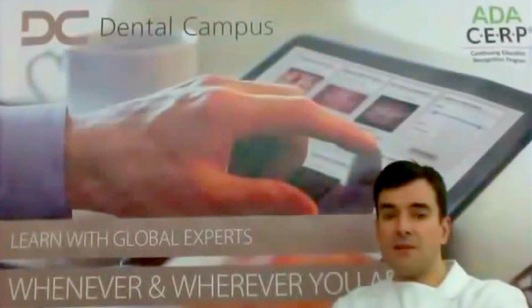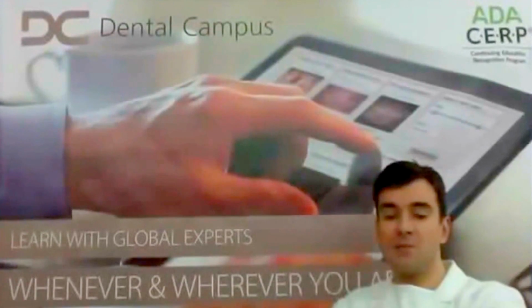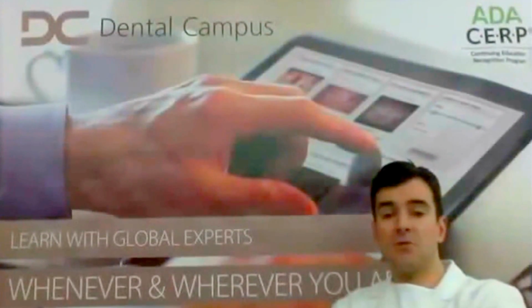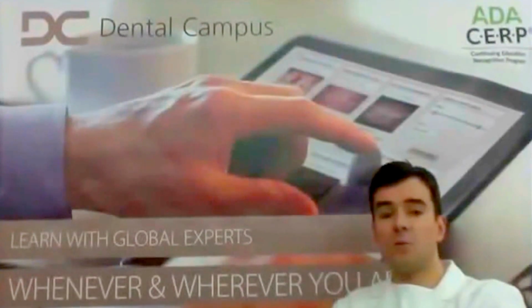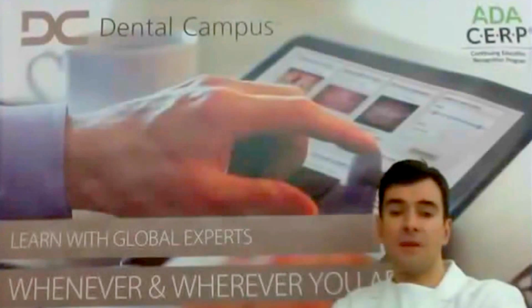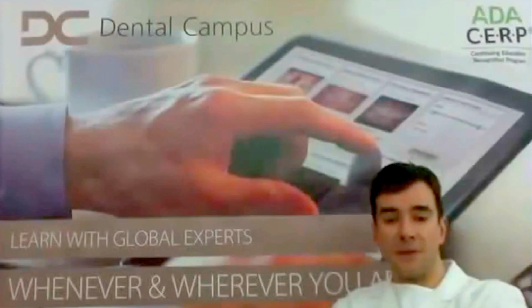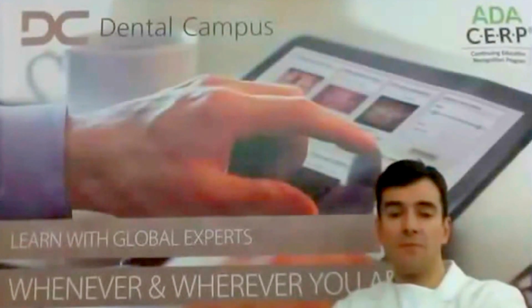But the interesting question is what about a situation with single implants, in which we have 2 missing teeth, which we can restore either with 2 implants and 2 crowns, or with 1 crown with a cantilever. And the problem is there is not a lot of evidence, not a lot of data with this particular reconstruction type.